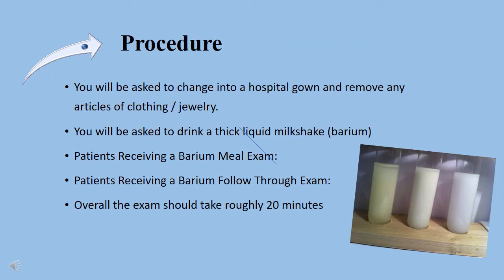Any unnecessary items that you bring in will need to be removed before the procedure. The milkshake-like liquid contains a contrast agent, and you may be required to swallow a small amount of bicarbonate, which helps visualize the stomach and the duodenum. Your abdomen may also be compressed to help spread the barium.